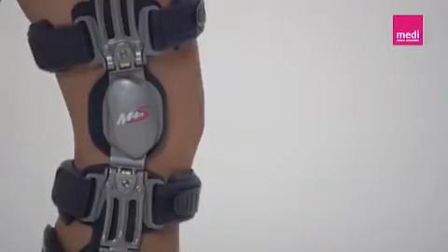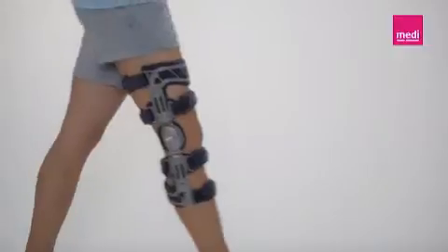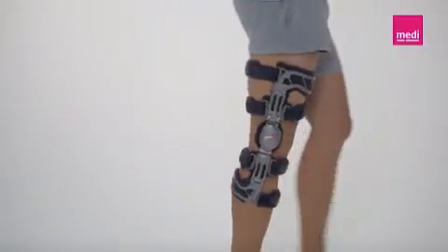The orthosis should, above all, be worn for activities that normally cause pain. For post-operative treatment, the orthosis should always be worn whenever the knee is weight-bearing.